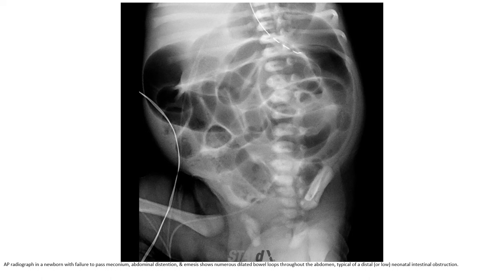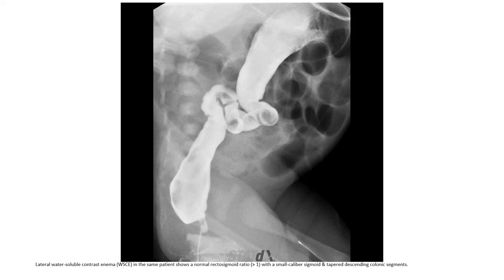AP radiographs in a newborn with delayed meconium passage show abdominal distension and numerous dilated bowel loops throughout the abdomen, concerning for distal neonatal intestinal obstruction. Water-soluble contrast enema in the same patient shows a normal rectal sigmoid ratio with a small-caliber sigmoid and tapered descending colonic segments.